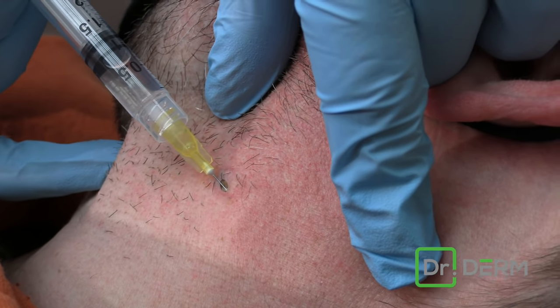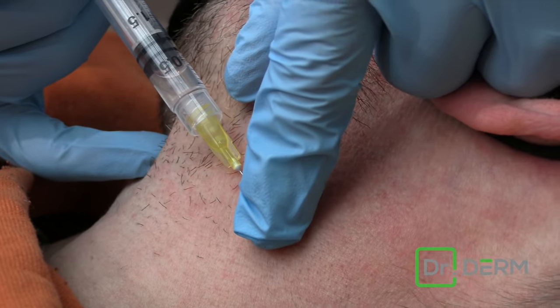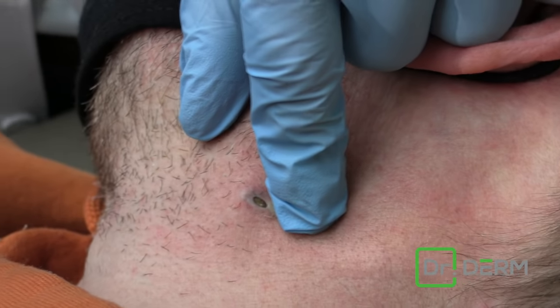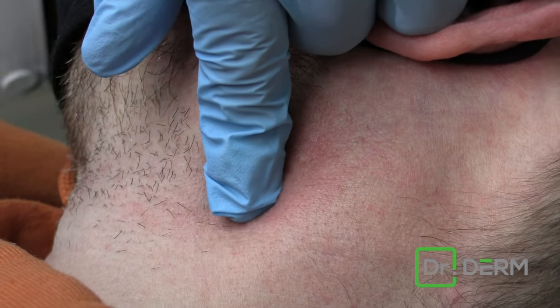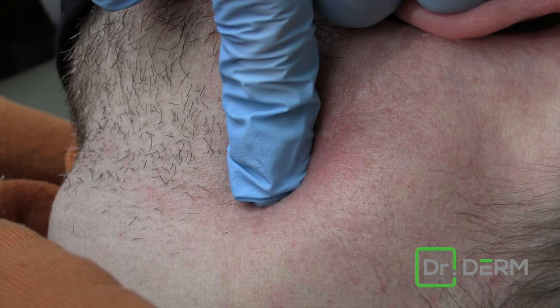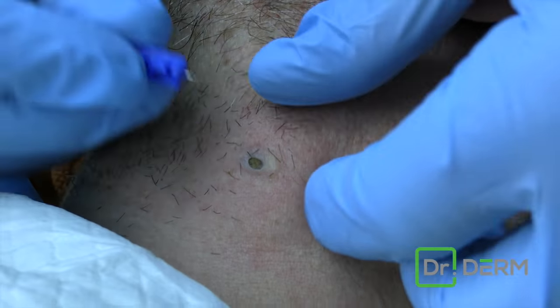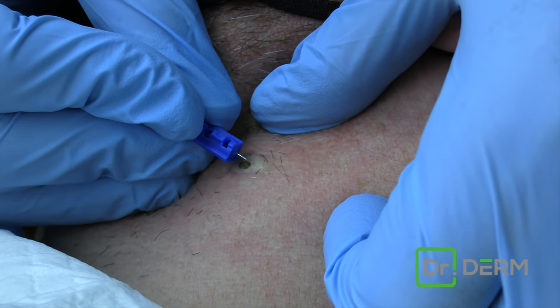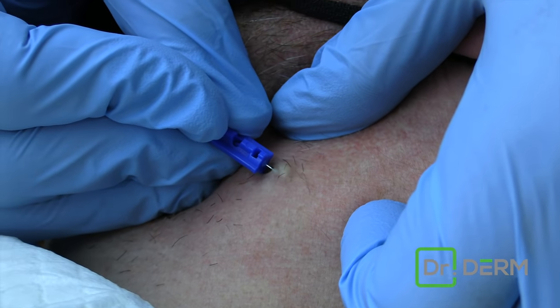And yeah, you want to come on this side, Scott, or what's the best side for you to do this? Actually, come on this side. So just put a little numbing underneath it. And sometimes I just hold it to kind of diffuse it a little bit. All right, we numb that up, and we are ready.